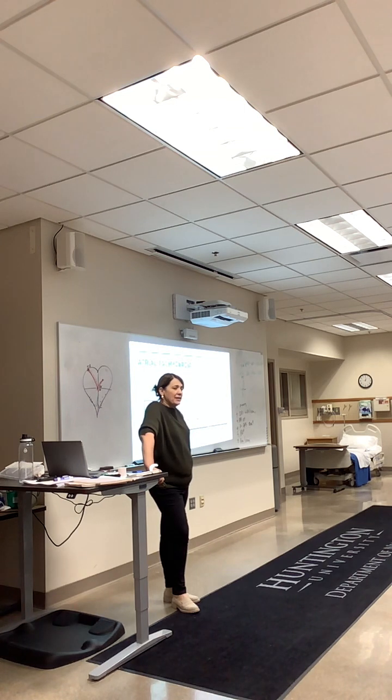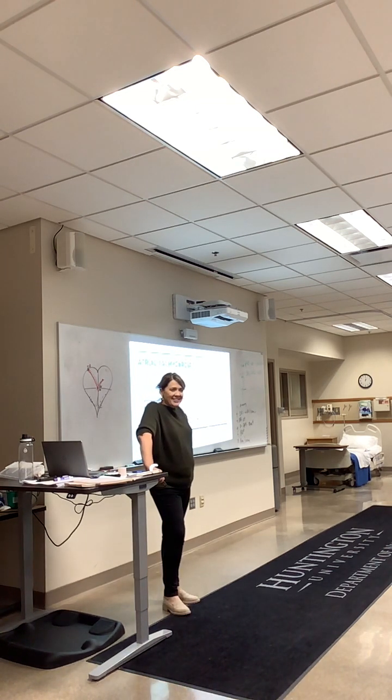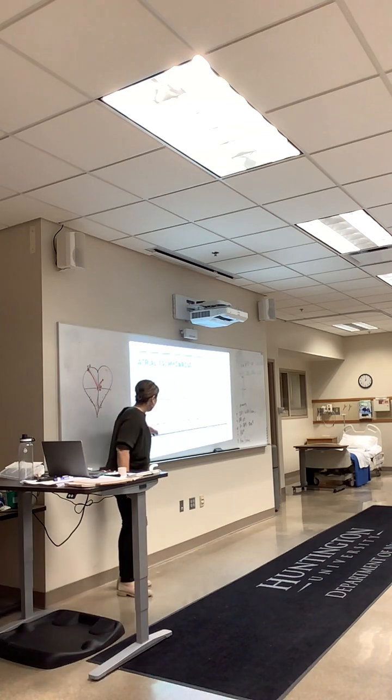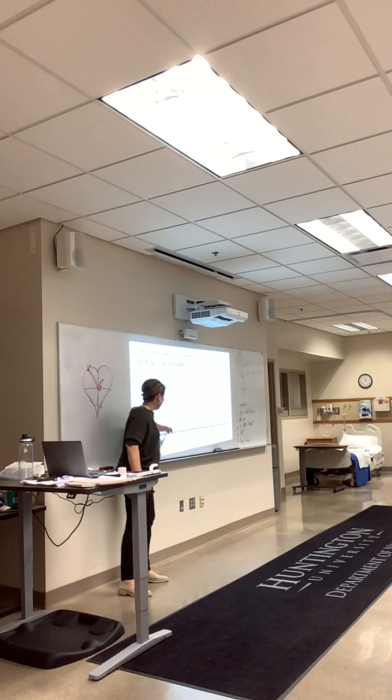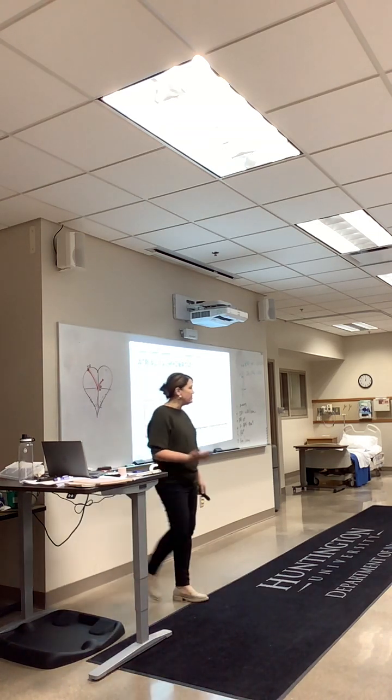This looks just like what? What did we already talk about that this kind of looks like? Looks like sinus tach, but it's faster. So if I go above 150, so 151 or higher, I'm going to call it atrial tachycardia, as long as I can still tell there's a P wave somewhere. It's stuck in there. So it's P wave, QRST, P wave, QRST, P wave, QRST. So there's still a P wave there.